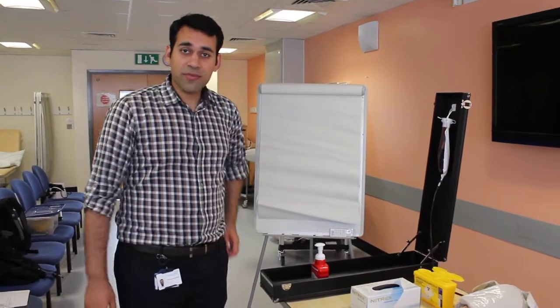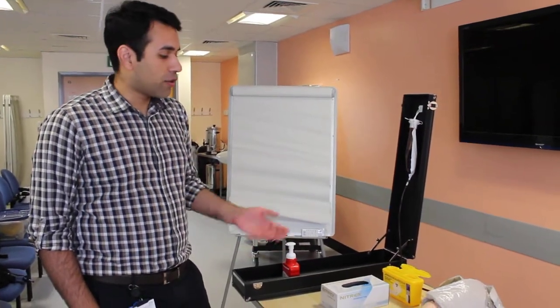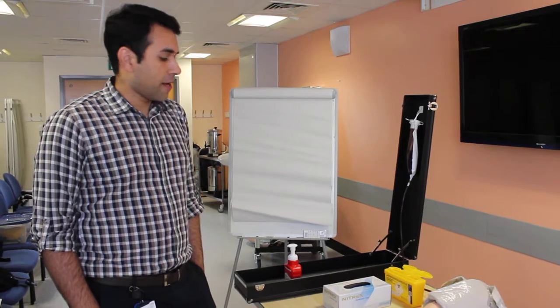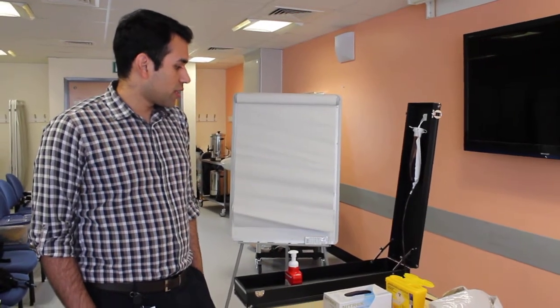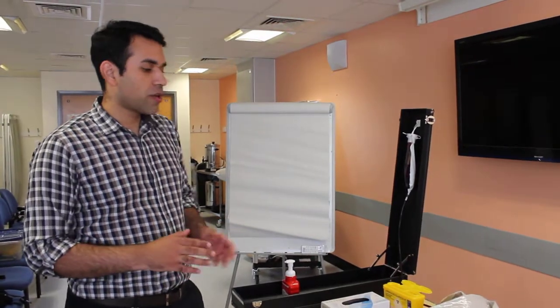Hello, my name is Dr. Cameron and today we're going to see how a proper venopuncture is done and how blood should be sent. During this procedure, I'll be speaking along the way so that you may know what I'm doing.